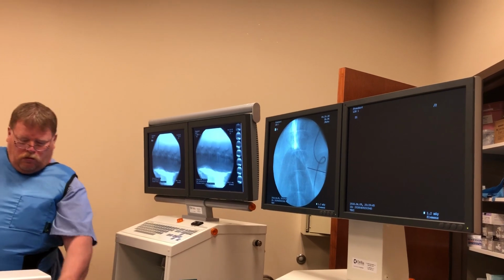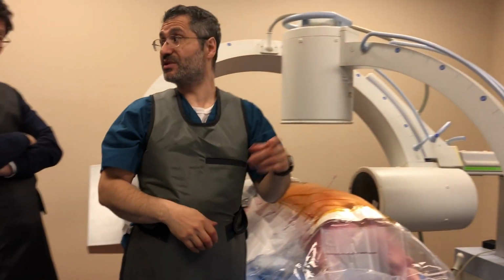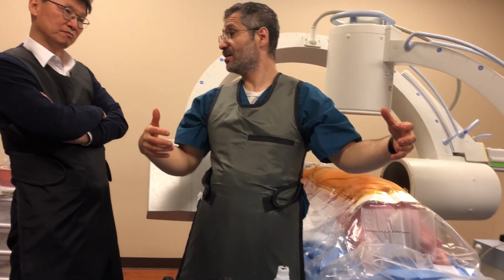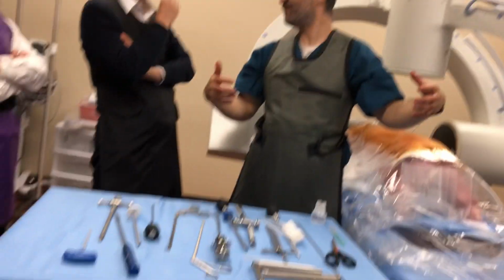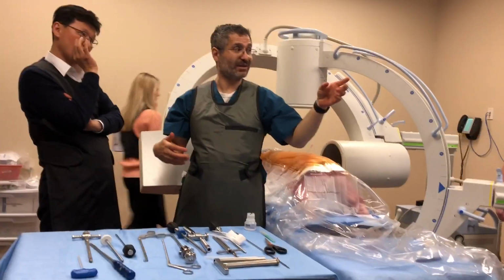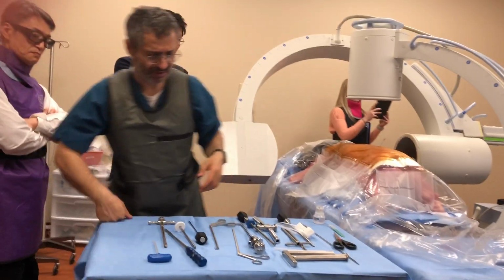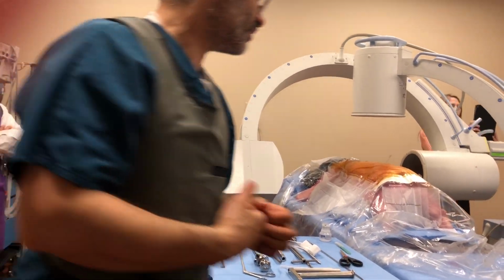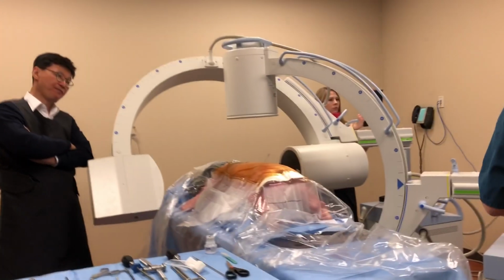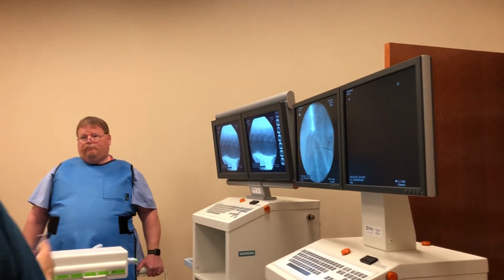Okay, lucky. Now, in surgery, I sometimes get pictures that are much worse than that. I mean, like 300 pound, BMI 50 and so on. Believe it or not, I see everything I need to see, and I think you do see everything that we need to see. Sometimes you see it better when you're afar than when you're close up.